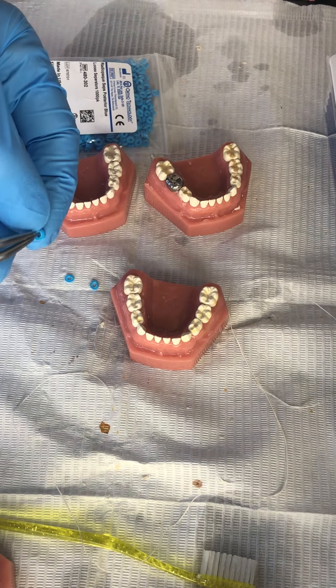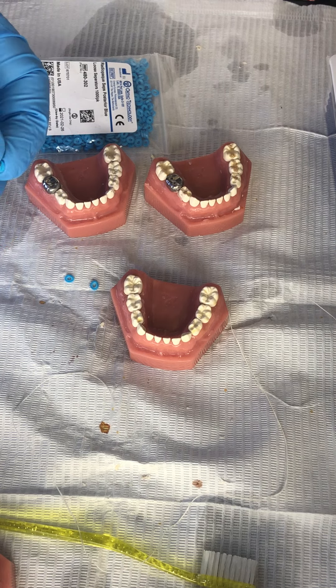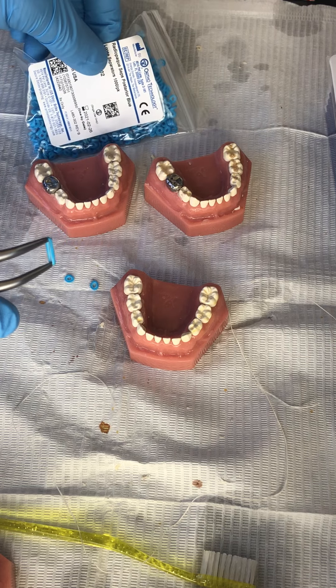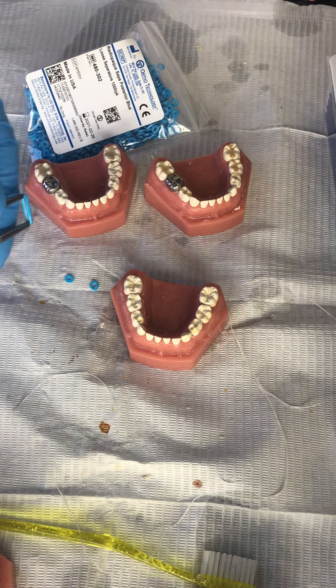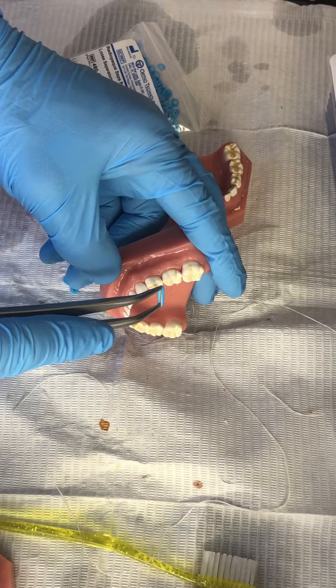We recommend the orthodontic separators — little rubber bands that are colored so you can see them, blue, and radiopaque. So if there's ever any doubt that they might have gone down a sulcus and still be sitting there, you can snap an x-ray, hypothetically.